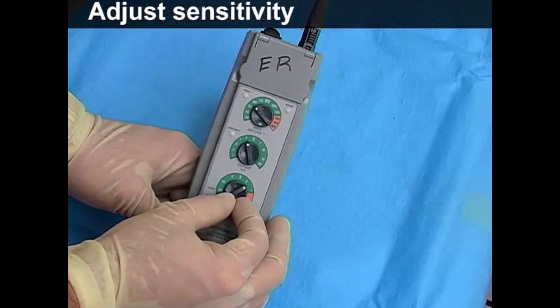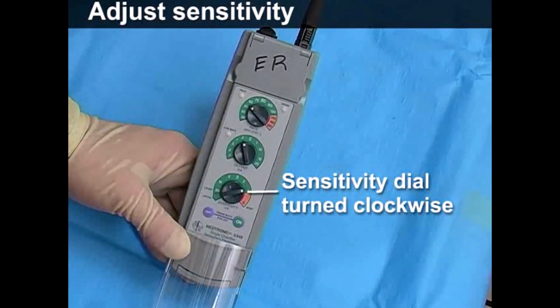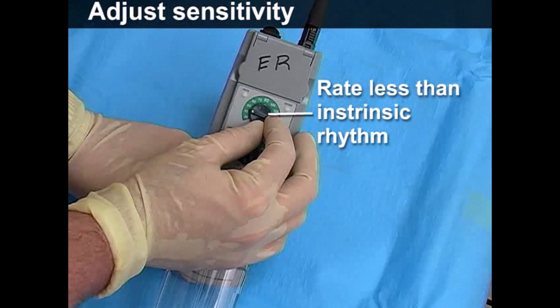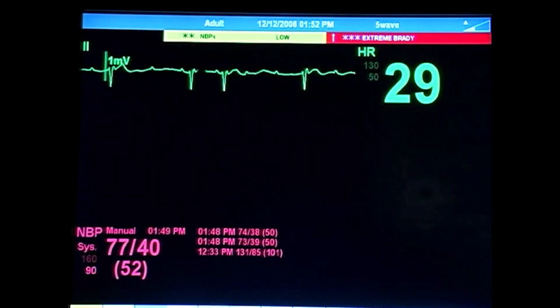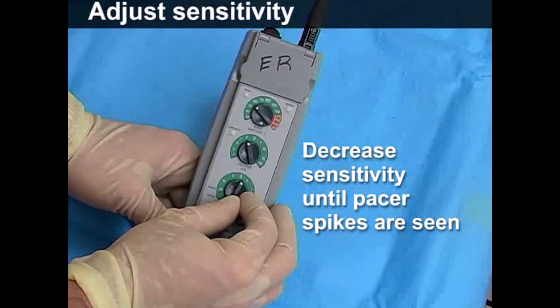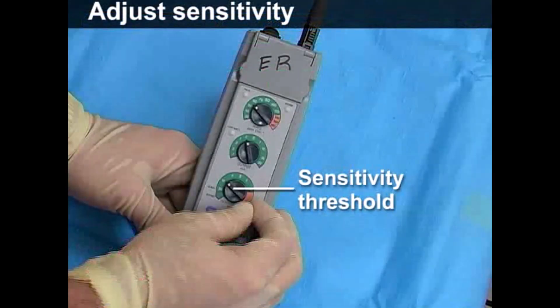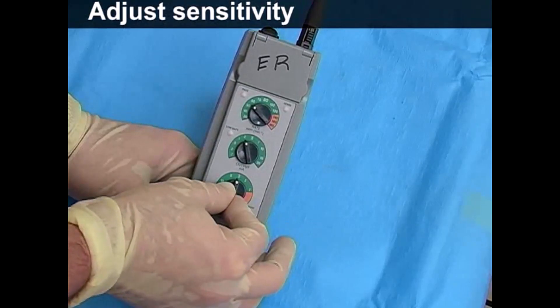Now, adjust the sensitivity. Begin in full demand mode with the dial turned completely clockwise. Reduce the pacing rate to a level 10 beats per minute less than the intrinsic rhythm. With these initial settings, you should not see pacer spikes. Slowly decrease the sensitivity until pacer activity is seen — this is the sensitivity threshold. Set the sensitivity dial to a point halfway between the threshold and the maximum value.